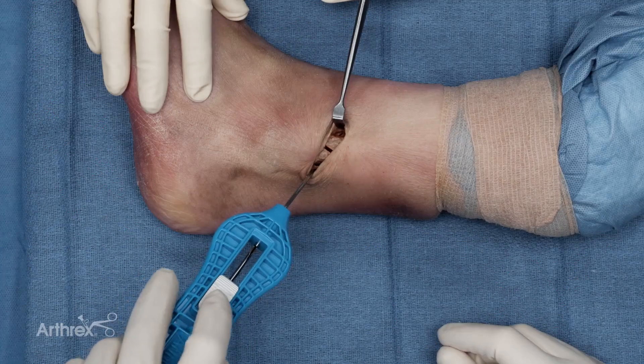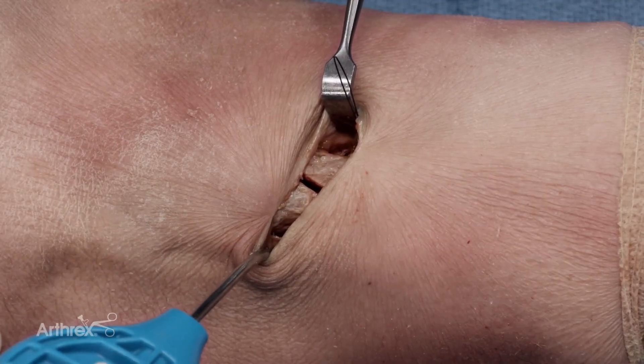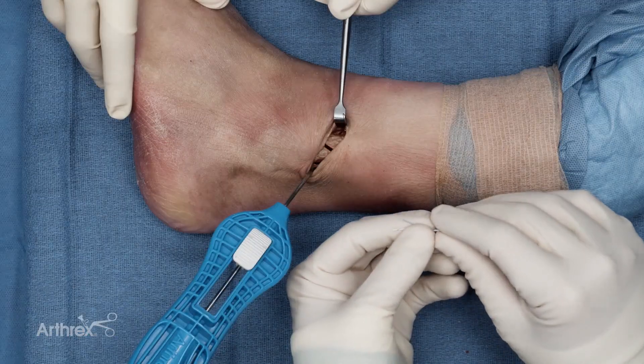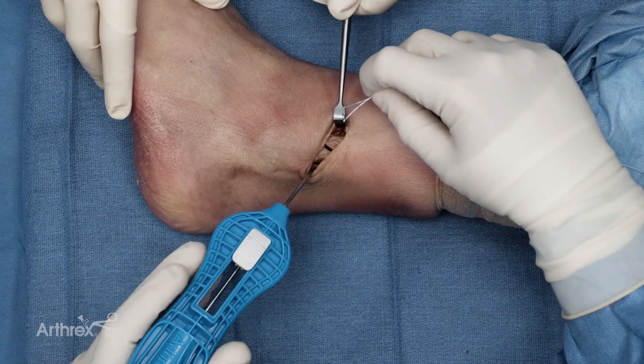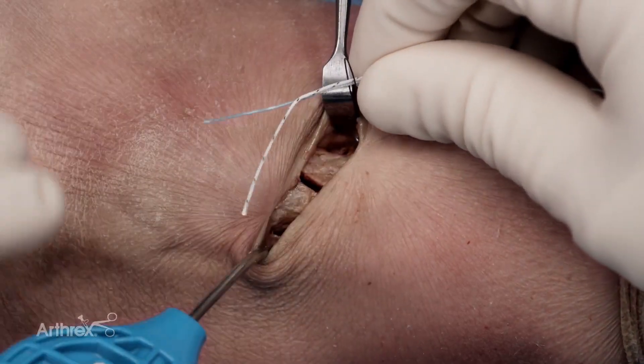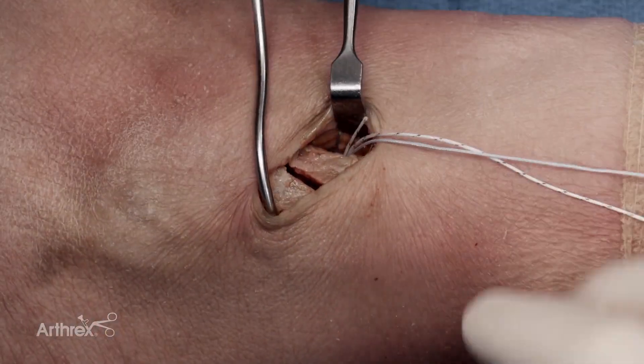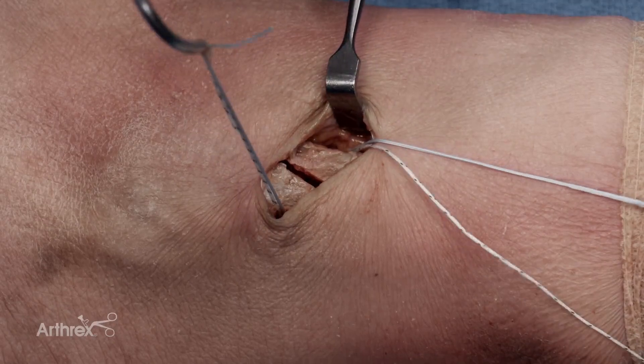Now we can deploy the nitinol loop, bringing it into the field to make the passing portion of the fiber tape cerclage much easier. I'm now going to pass the fiber tape cerclage as well as a fiber link into the nitinol loop, and then by pulling that back into the passer I can bring the fiber tape cerclage and the fiber link around the fibula.